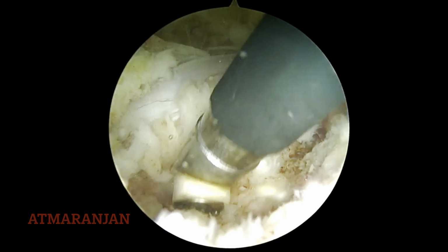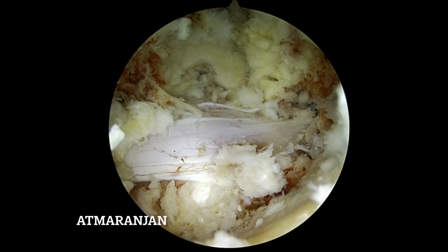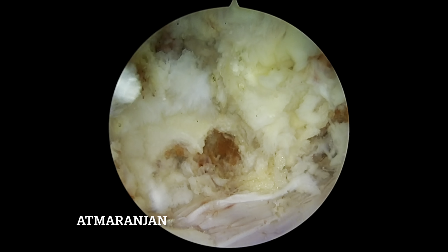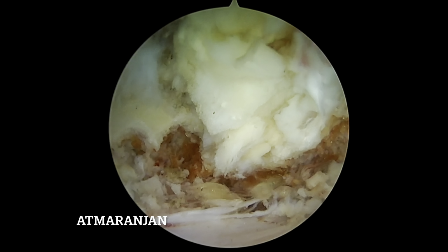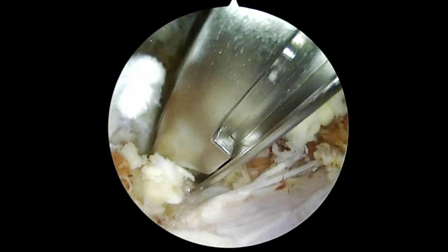Now we started using the radiofrequency probe to clean out the area of the annulotomy so that we can put our instrumentation. So now a wide area has been created lateral to the cord bilaterally, so that whenever we retract the roots to put the cage, pressure does not transfer to the neural structures.